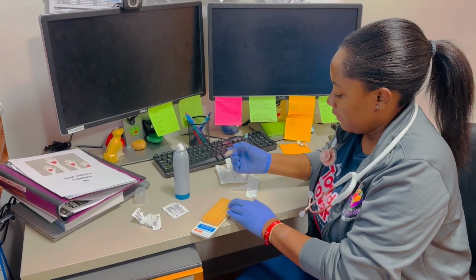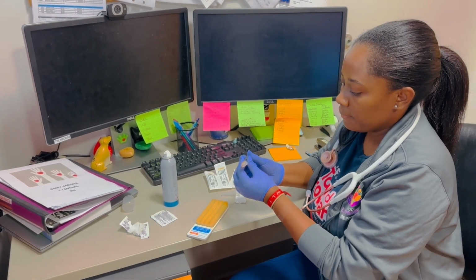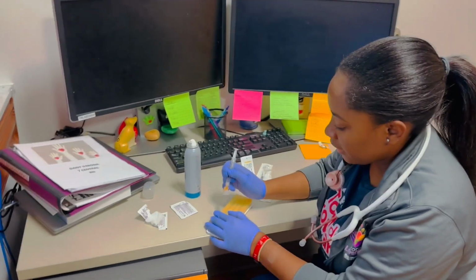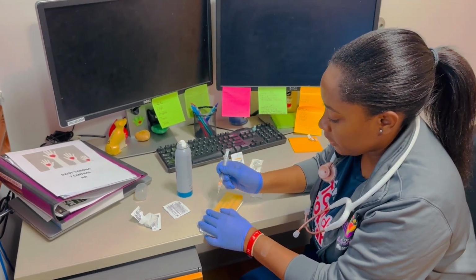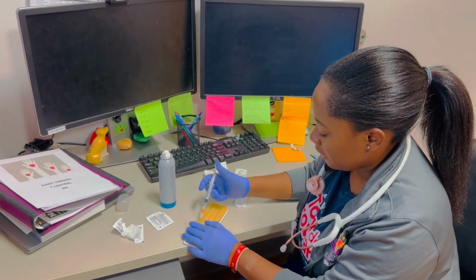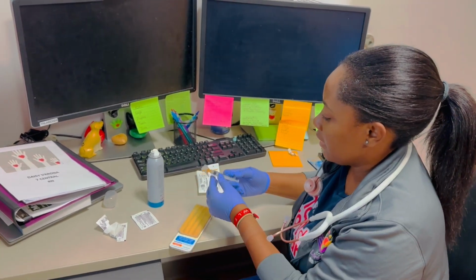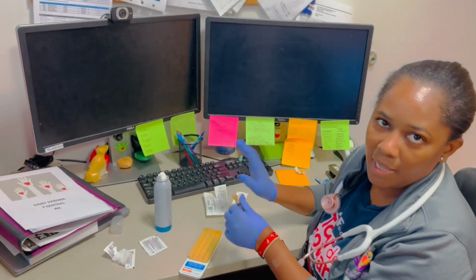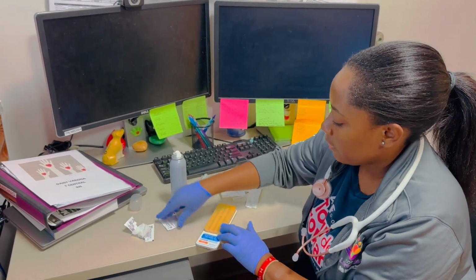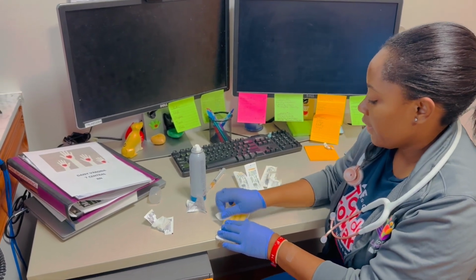Okay, all right, so my site's already clean. I already have my medication in there, just like I mentioned. So 45 degrees is going to look more like this angle. 90 degrees is going to be straight down, but 45 degrees is more towards this angle. So I'm going to go ahead and inject my patient, give my medication, and then take it off. You never want to recap needles or anything like that. Just close it up and throw it away in your sharps container. Okay, just grab a new alcohol wipe, clean the site, and then you'll be all set.